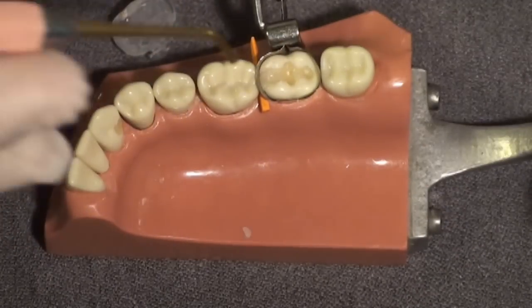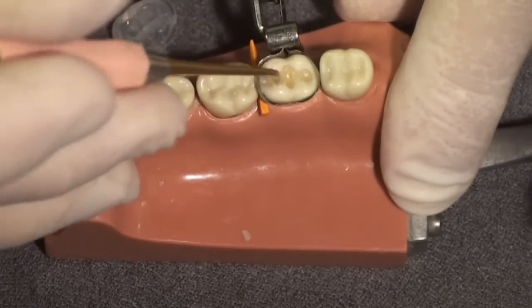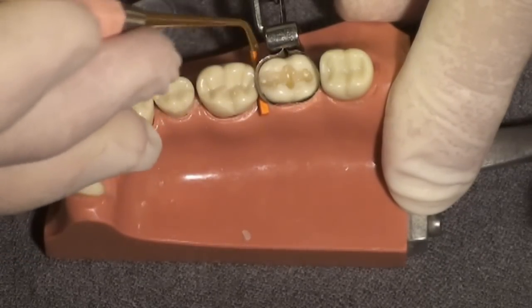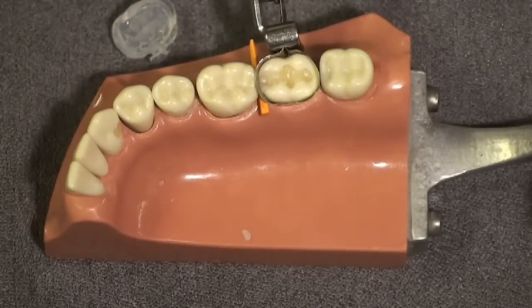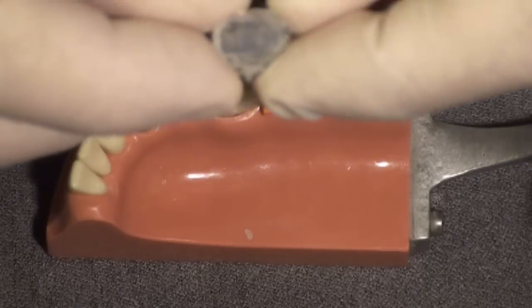I am removing some of the composite here, and now I'm going to replace the custom matrix that was sitting on the bracket table.